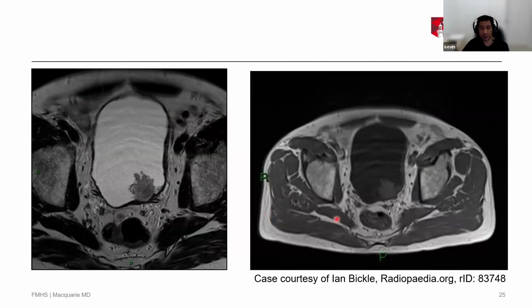So you can compare this with the CT. Here you can see the bladder wall very nicely, whereas the CT was all a little bit gray and fuzzy. This is also gray, but it's much easier to see tissue definition. Muscle, you see more of the structure of muscle. You can see the planes between the muscle.